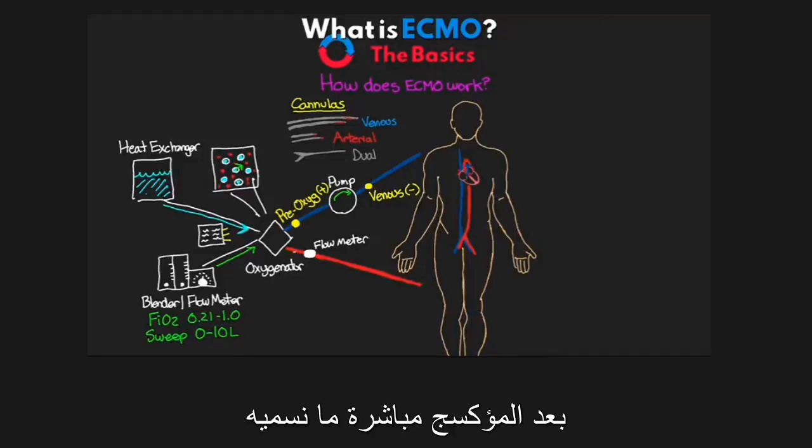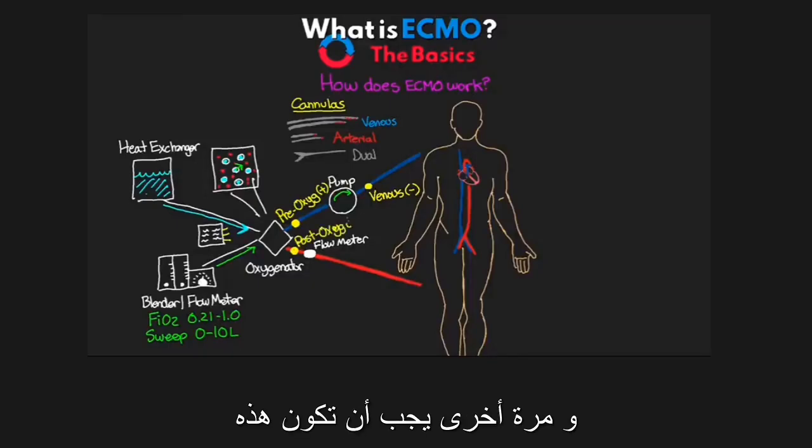what we call the post-oxygenator. And again, this one should be a positive value. And this one is looking at the amount of resistance past the oxygenator to the patient.